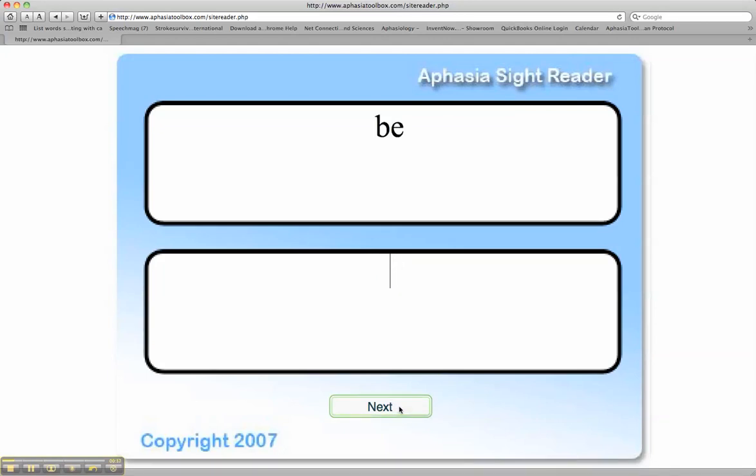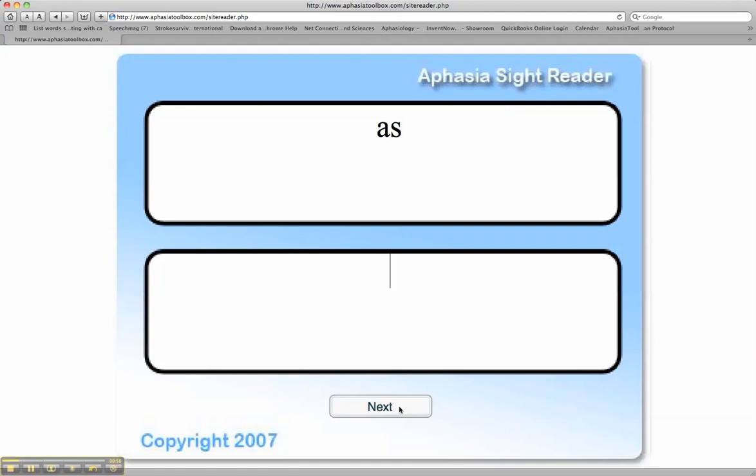We encourage the client to pay attention, focus, process, and then type the word from memory. This helps the client know where to put their focus, maintain the focus, sustain their focus, and then type the word.